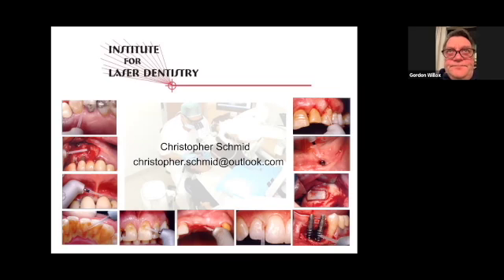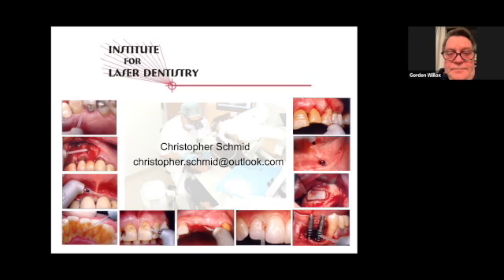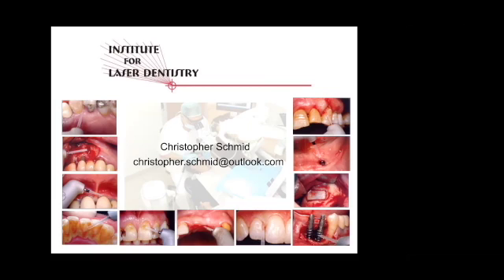So when I was looking at lasers, it was primarily to do troughing around abutments for crown and bridge, for taking impressions. I came across one because one of the offices I visited had something called Blue Wave, and it was a diode laser. Is diode a certain wavelength, like around 800, and CO2 is different from diode? Or how is all this nomenclature? What does it mean? Can you give us a quick talk on that?